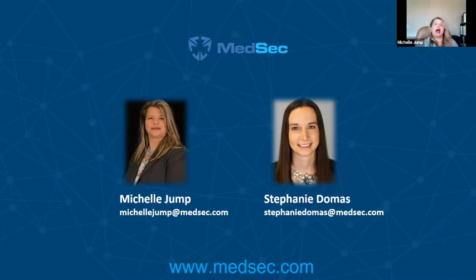Yeah, actually, this has been a hot topic as well. I talk about this topic in TIR 57 a lot. It was fairly recently that the FDA, in a public forum at a conference that Stephanie and I actually chaired together, did say that just trying to assess security risks through a safety perspective is not enough. And I followed up and talked with him about it later.